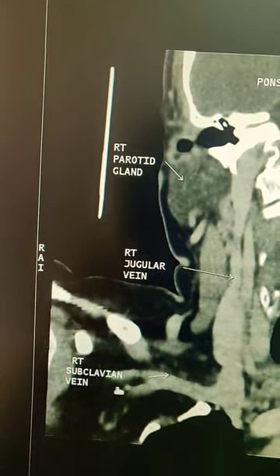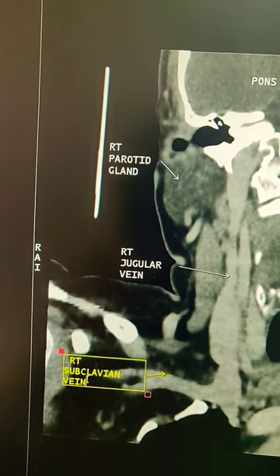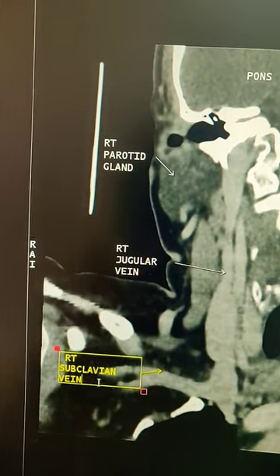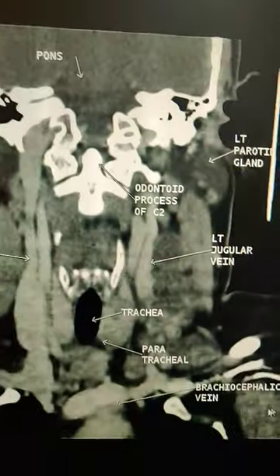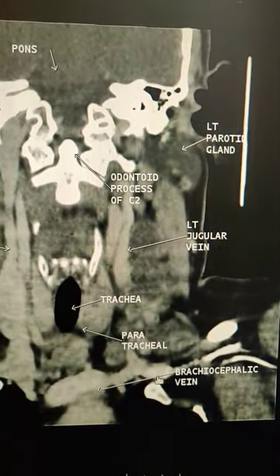Coming to the right subclavian vein. Left subclavian vein.